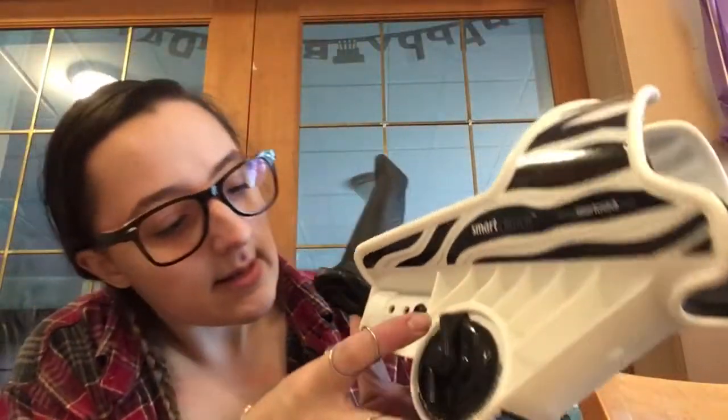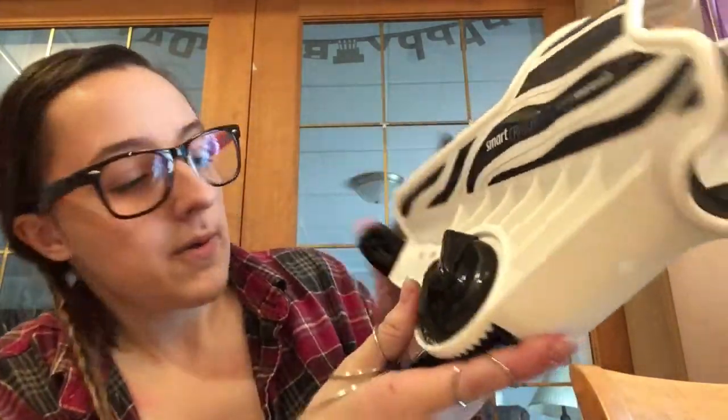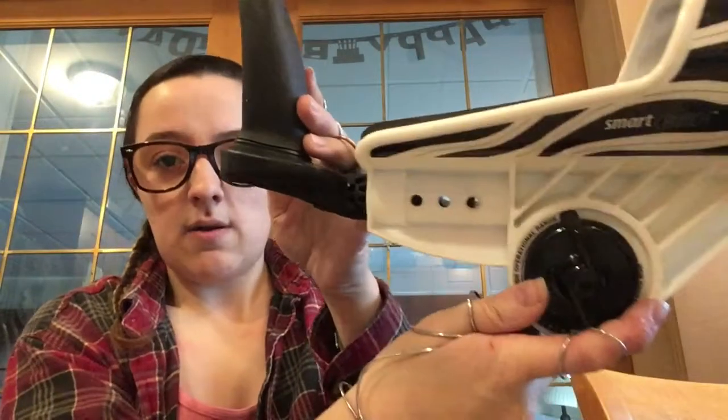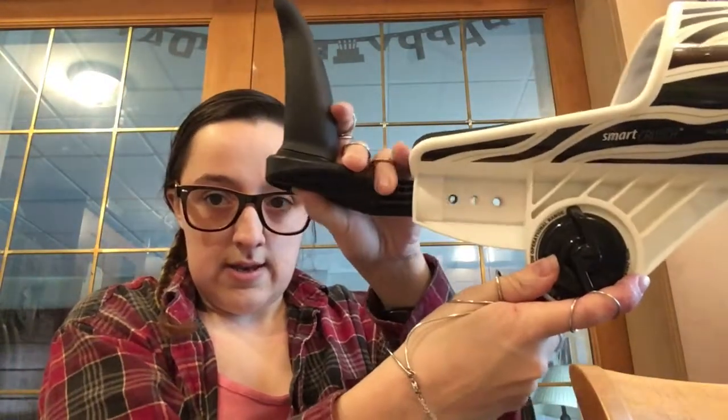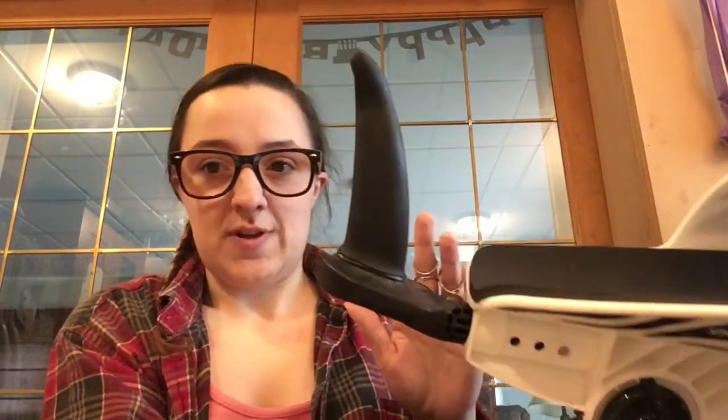Now, I don't want to lose pieces is the thing. So there's two little washers, this little tiny one, and then this bigger one, and then this little bolt comes out. And then now you can move this adjustment. So now it's on the second hole, and then the third hole. So I'm gonna see where it's most comfortable for me.